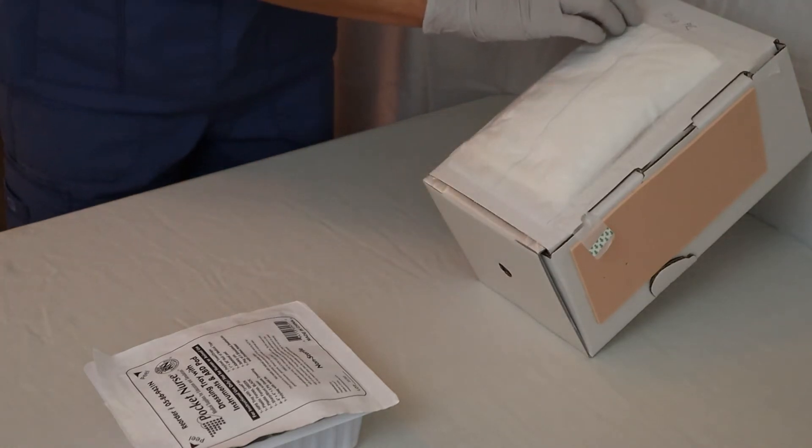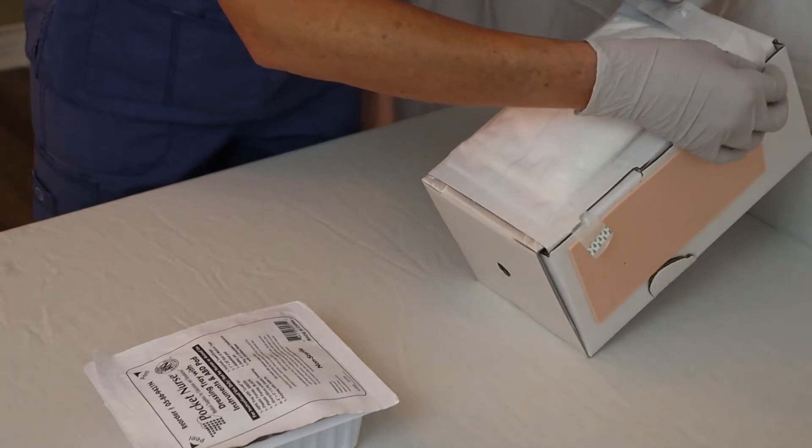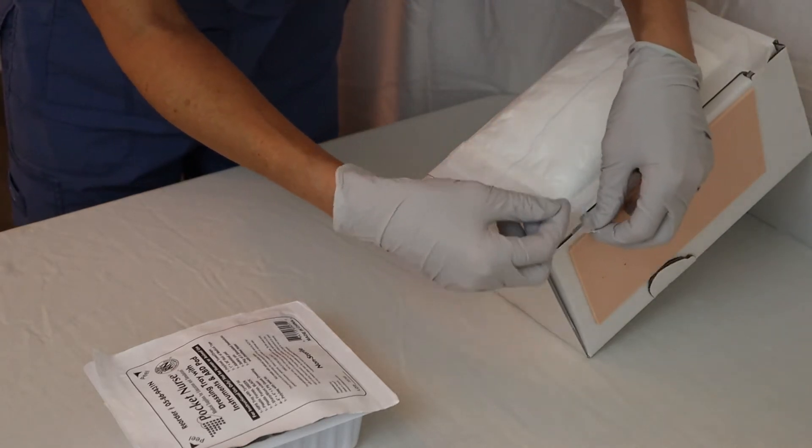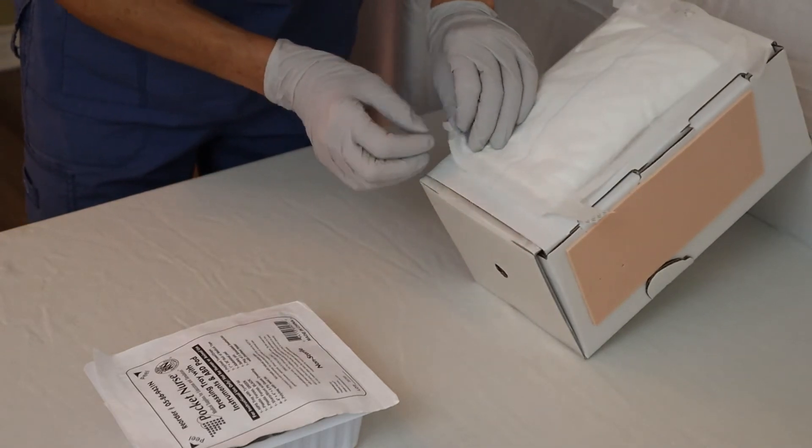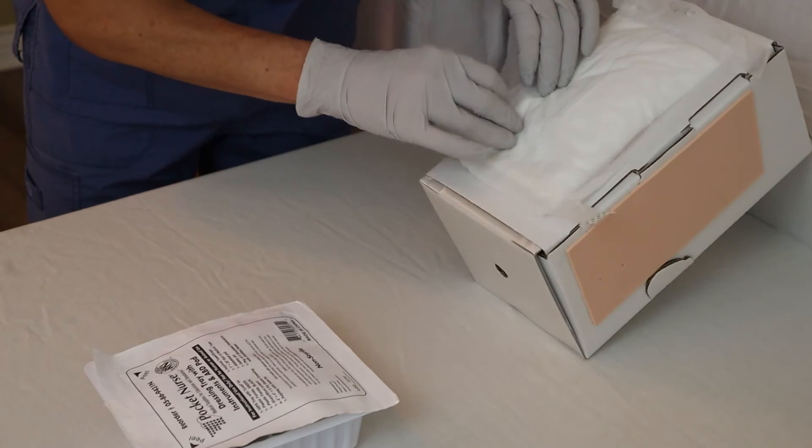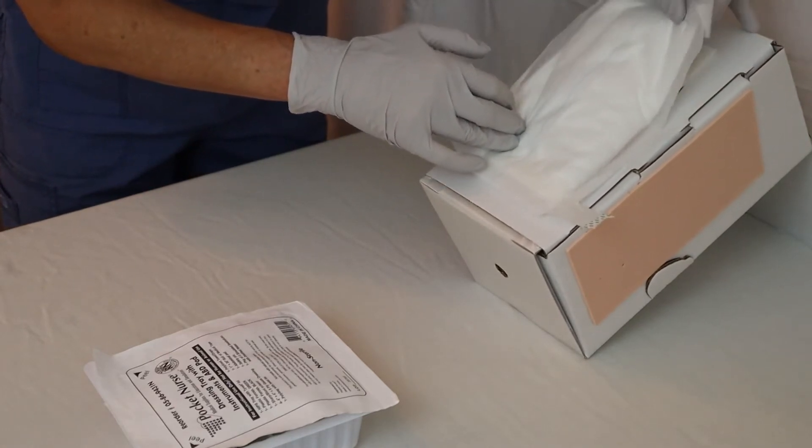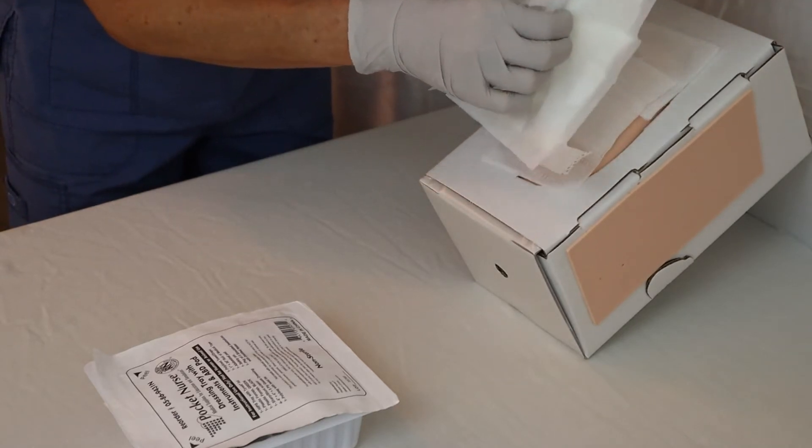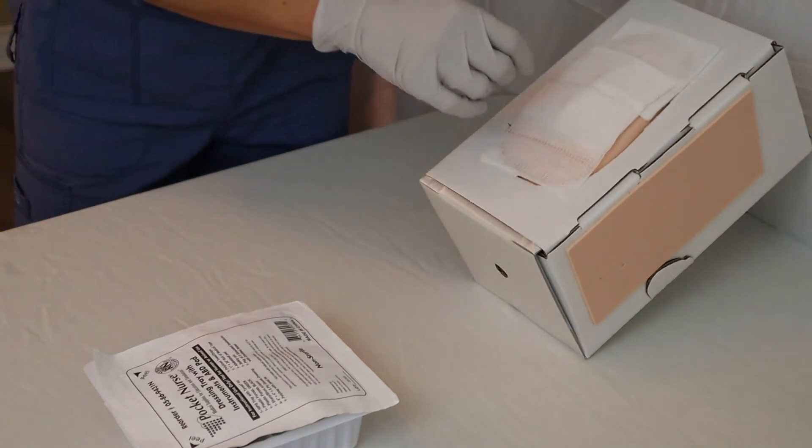Now I'm ready to remove the dressing. So I gently want to remove the tape. If the tape sticks too much to the patient, you can always look for these tabs. But if there's no tabs, you can take a little alcohol and wipe underneath the tape, which will help to dissolve the adhesive. I loosen it up all the way around first, and then I will just remove the dressing and throw it right down into the trash.